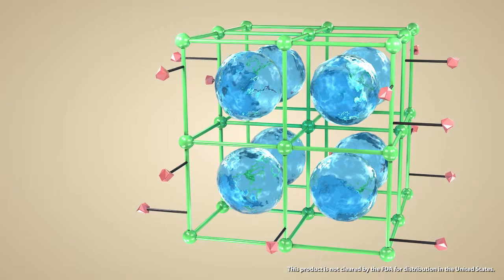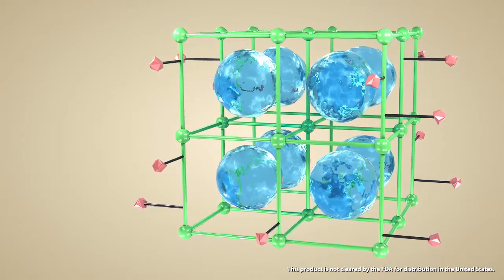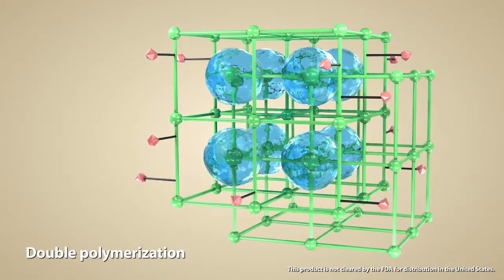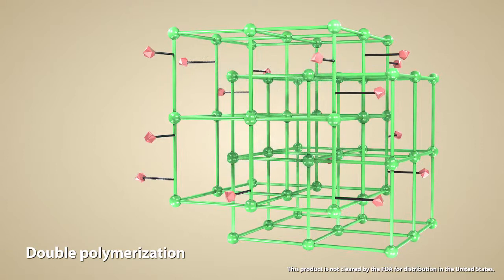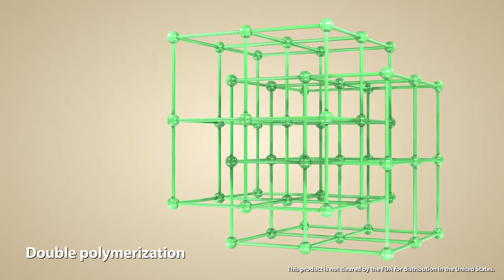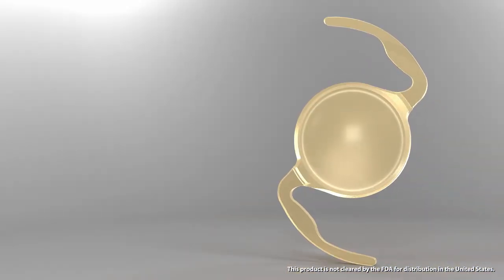A stable and steady structure is formed within the polymer molecule through a unique manufacturing process called double polymerization. This eliminates water components, along with unreacted monomers within the polymer network, reducing the incidence of glistening and subsurface nanoglistening and ensuring long-term reliability.